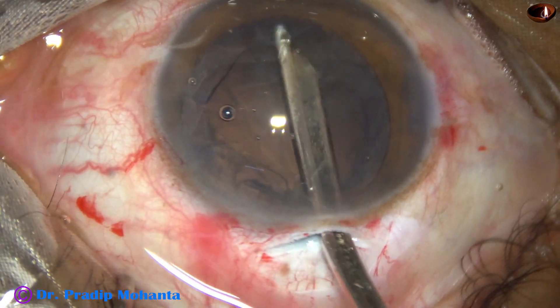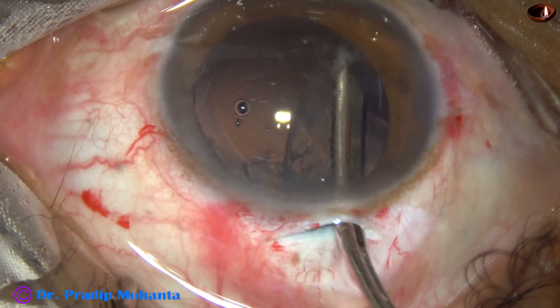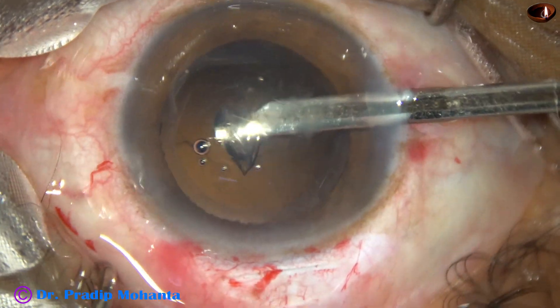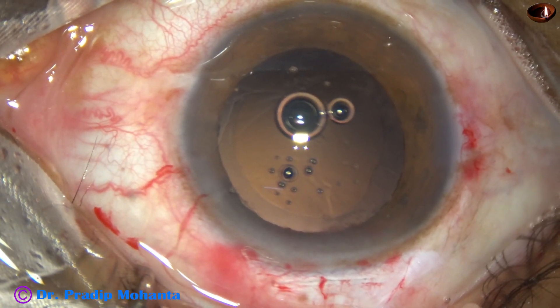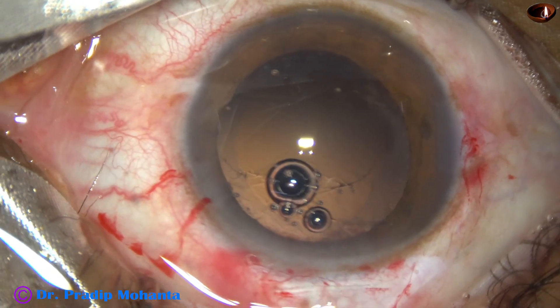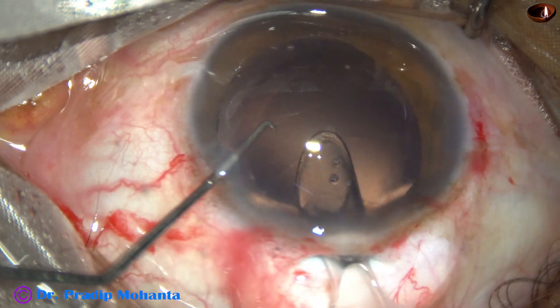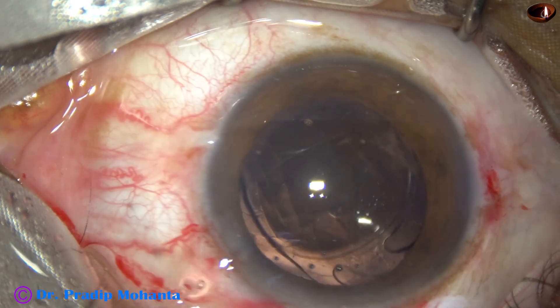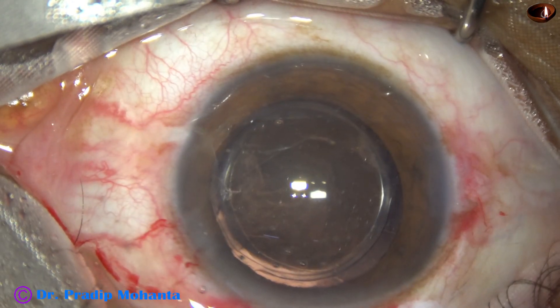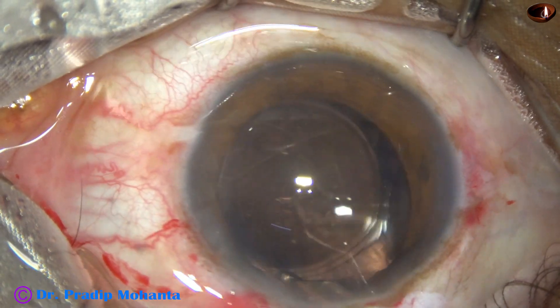Now I am going to use a 22 gauge Simcoe cannula to remove the cortex easily. I go through the side port and remove all the cortex. Then I fill the capsular bag as well as the entire chamber with viscoelastic substance — 2 percent HPMC. Using a cartridge and a foldable intraocular lens, I place it in the bag. You can see that the optic of the intraocular lens has been overlapped by the anterior capsular rim, which means the size of the rhexis is less than 6 millimeters.